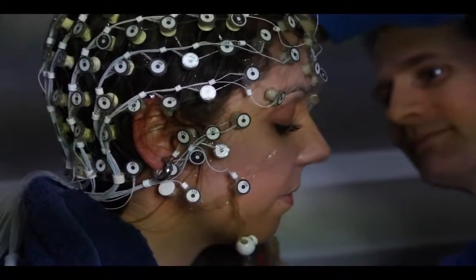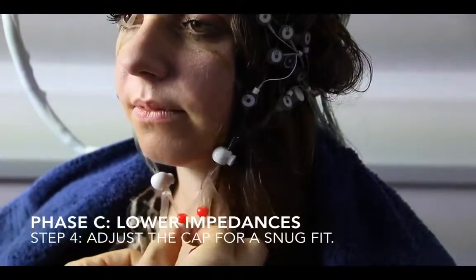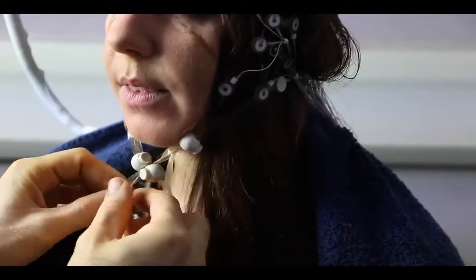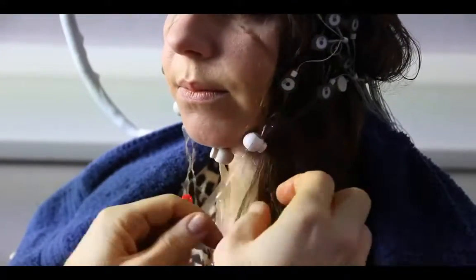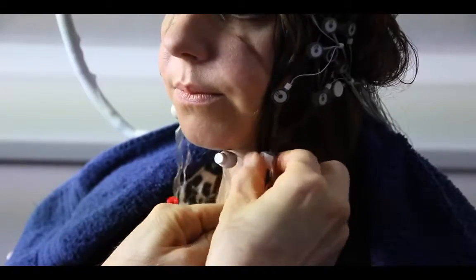Next, you'll adjust the cap so that it has a very snug yet comfortable fit. It's important that the fit be snug because the more the electrodes press down onto the head of the scalp, the easier electricity can be conducted to the electrodes. But of course, you also want the participant to be comfortable.